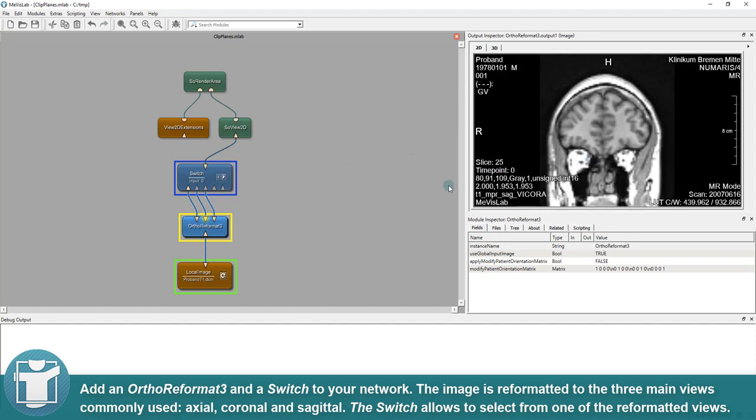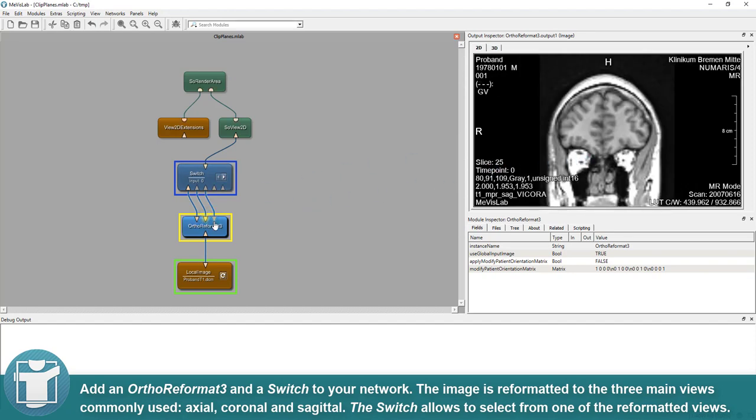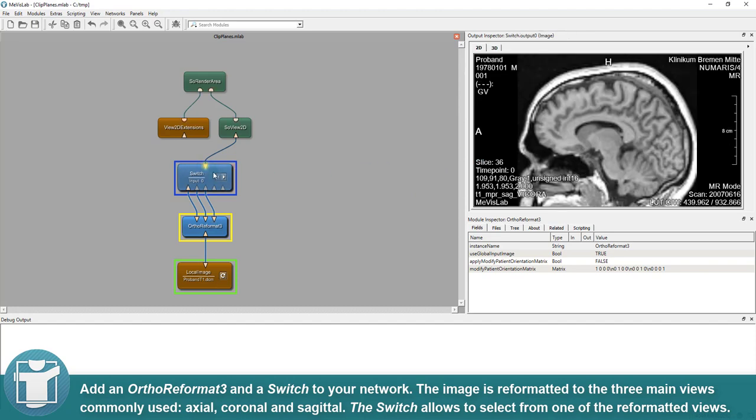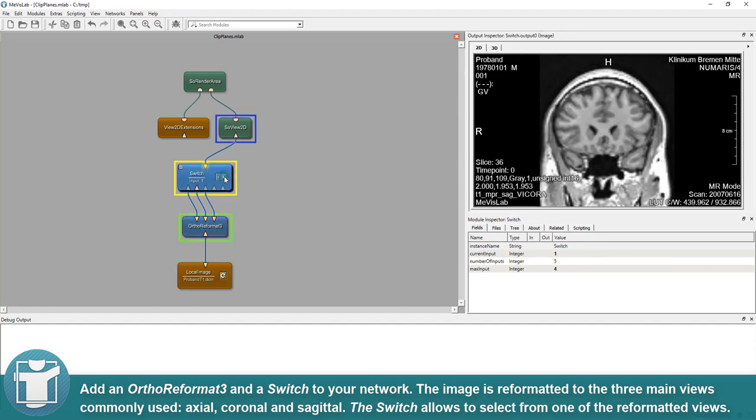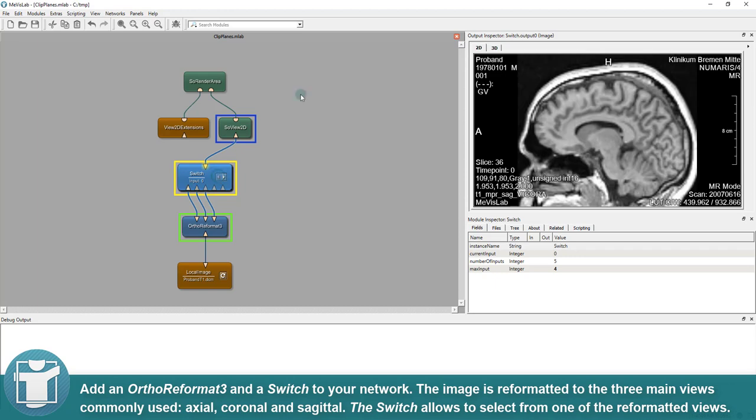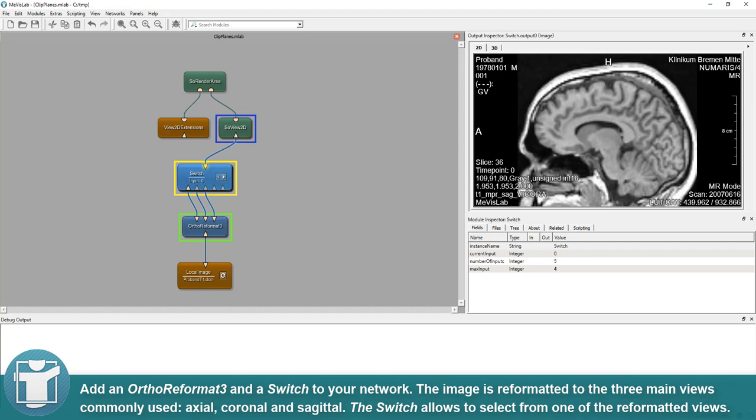The image is reformatted to the three main views commonly used: axial, coronal and sagittal. The switch allows to select from one of the reformatted views.